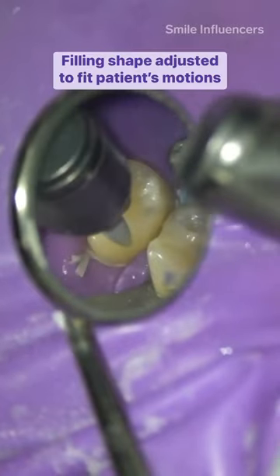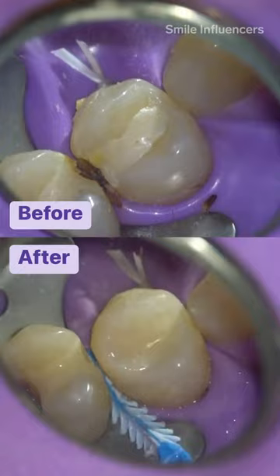We are adjusting the shape of the filling. We're hoping that there is no interference between the patient's motions and the new filling that's in place.